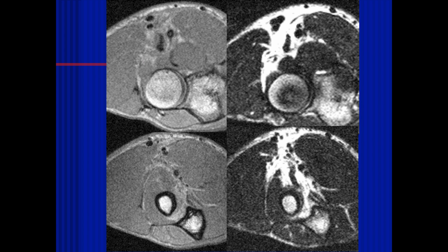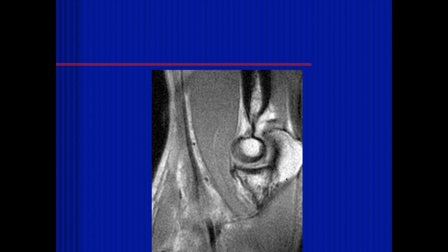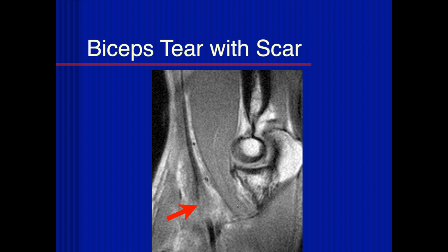And then if you go to the T2 weighted images, this is actually the tendon. The T2 weighted images allow us to differentiate the tendon from the surrounding granulation tissue. But this is a high-grade chronic partial tear of the biceps. These tend to be symptomatic, and in this case, with a lot of scarring in situ. Here we can see scarring, and I think this is the same patient with thickening and splaying of the distal biceps and a lot of scar tissue there. This is the brachialis going into the ulna. I think that ended up being a chronic tear with scar in situ, but again, it's not functioning properly. And for those patients who are symptomatic, where it's a problem, then they can do surgery.